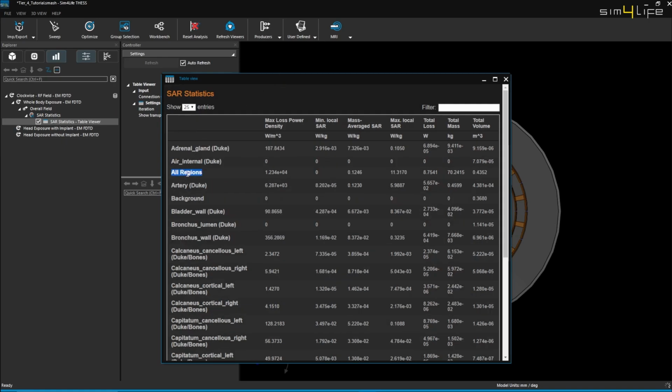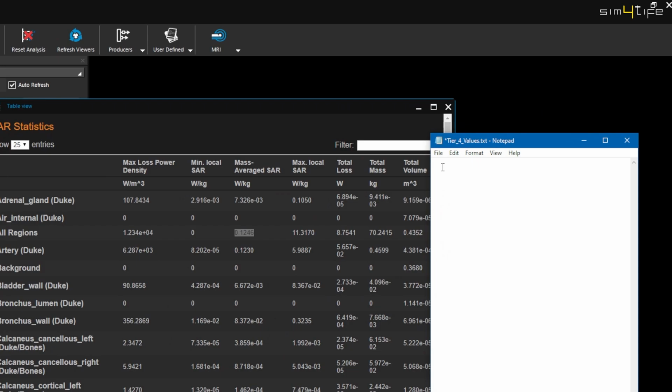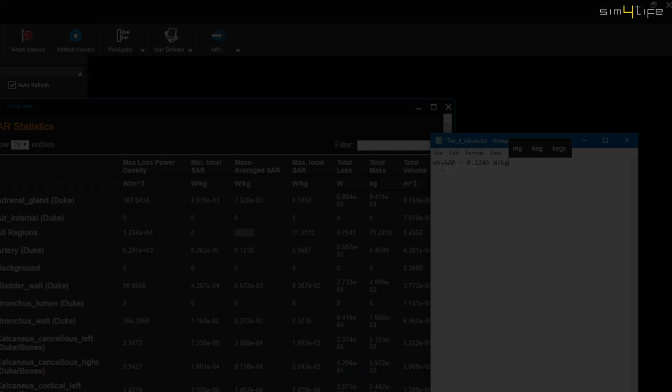In the table, sort the simulation entities by name by clicking on the far left cell in the header row. Locate the All Regions row. Focus on the Mass Average SAR column. This value represents the whole body SAR in watts per kilogram. Note down this value to use it later in the normalization of the deposited power around the implants.